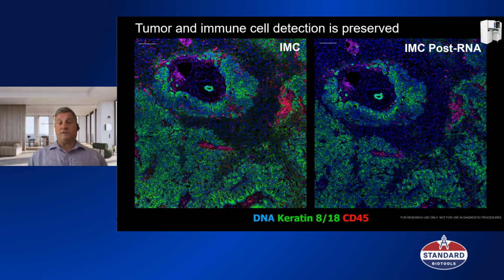There are some differences in intensity, which is probably to be expected because there's a protease step in the Xenium. But for the most part, it's quite good. And I would say that probably 80 to 90% of the markers that we have tested have been working. So it's a really good transfer of being able to do full spatial transcriptomics and then full proteomics on the sample afterwards.